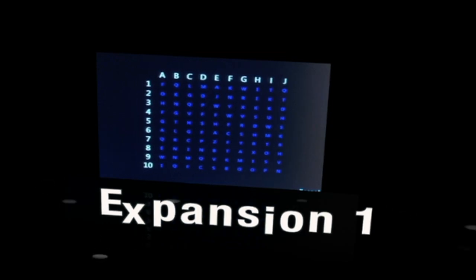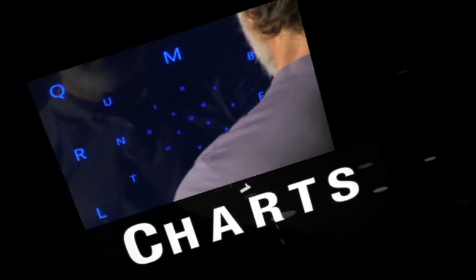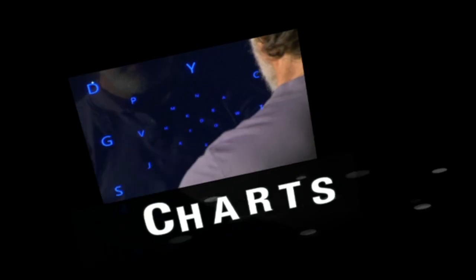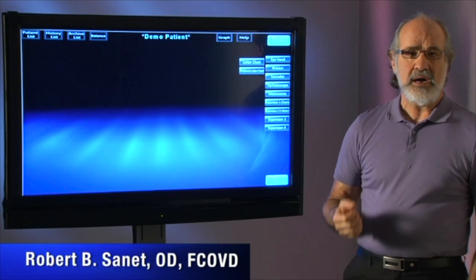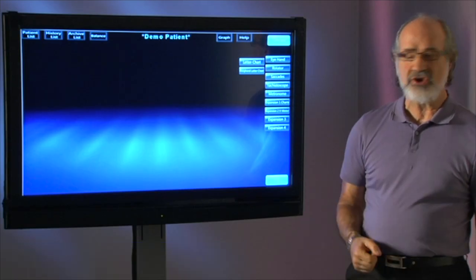Hi, I'm Bob Sanet. I want to speak about an exciting new expansion program for the SVI. It's called Charts. I'm going to go through each different program to show you the dynamic aspects of the Charts program.